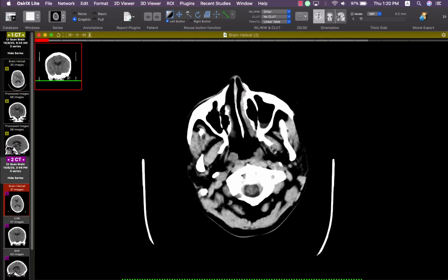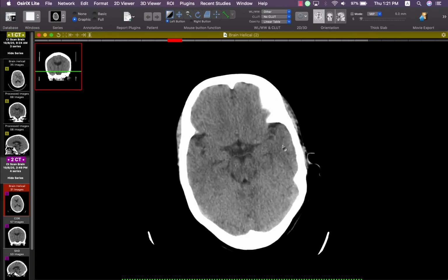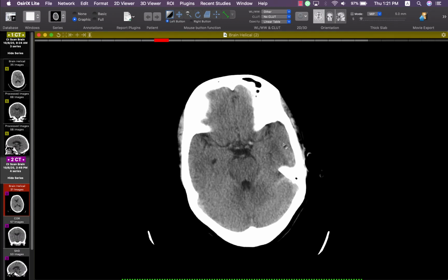The signs we spoke about before are the earliest signs, before a hypodensity develops in the cerebral hemisphere. If we pick them up early and the patient is treated properly and immediately, we can save the patient. But as I said before, the best modality in cases of acute ischemia is MRI.